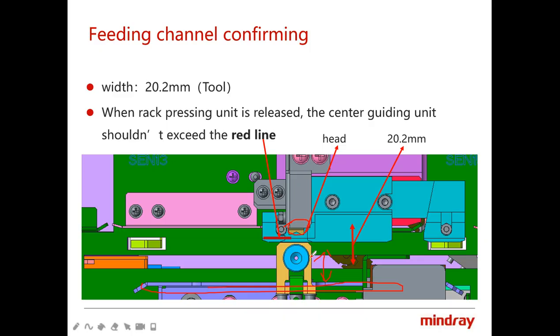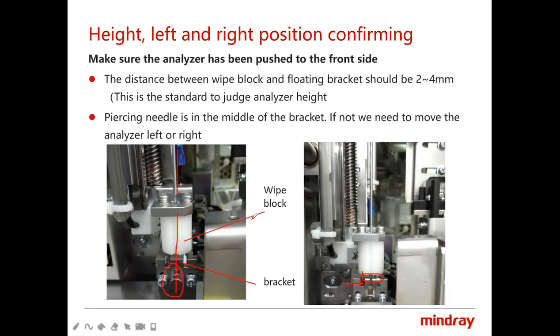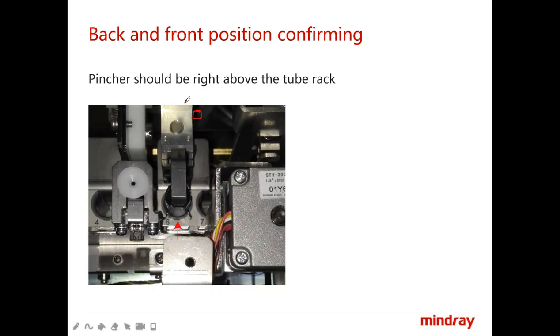And after we confirm this part, we need to confirm the piercing probe's position. In fact, this page should not be here.